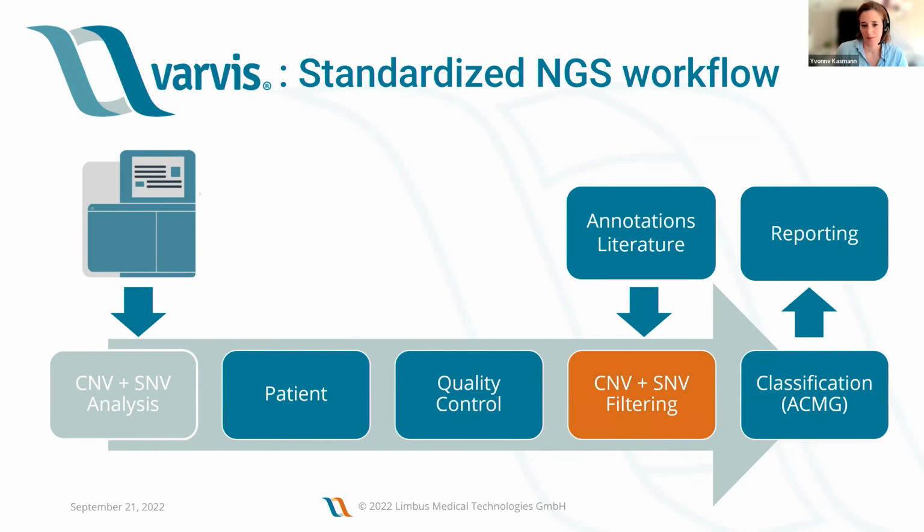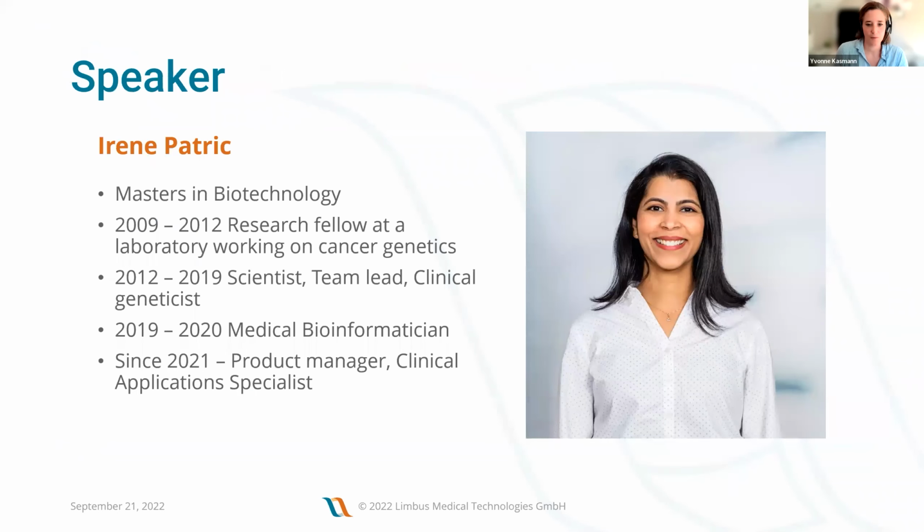And this step, the CNV and SNV filtering, can be the most challenging step, where you would need a lot of features to help you to save some time. And so I would like to hand over to Irene. She will show you in the software what kind of features we're offering, especially for whole exome cases.